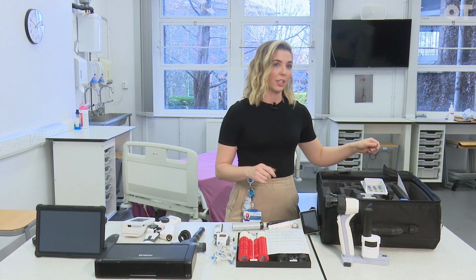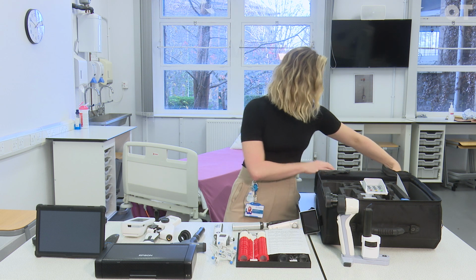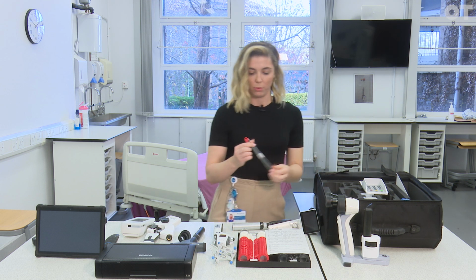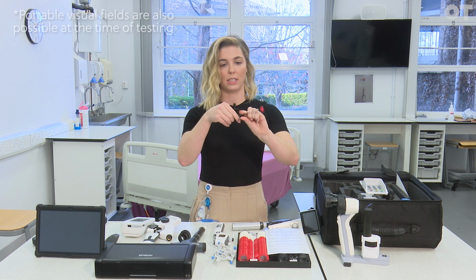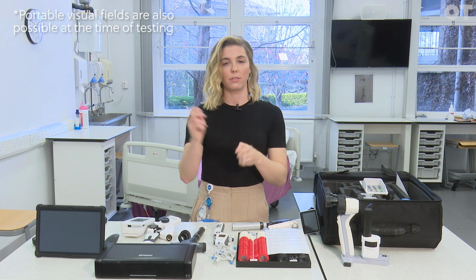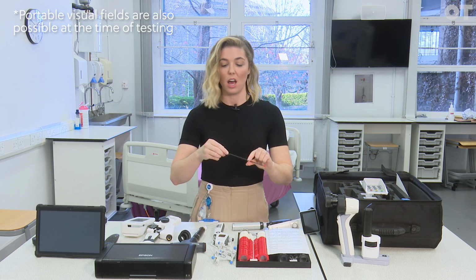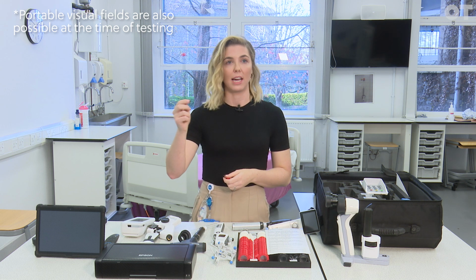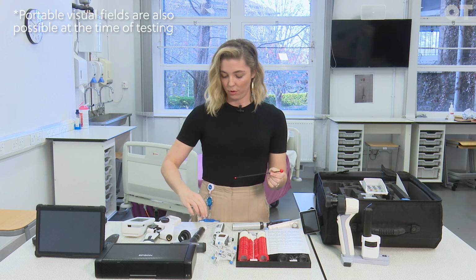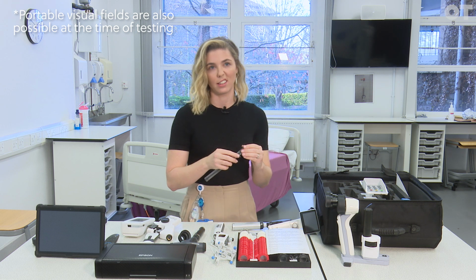So if we've got a patient who we need to perform fields on, the simplest way to do that is confrontation. Most people will have seen a confrontation stick in the past. You've got big end, little end. Those are really great just to get any sort of gross field defect. A lot of our patients will have had strokes in the past, so checking that is obviously essential. If anyone needs anything further, obviously we can refer them for further field testing if we think that it's required.